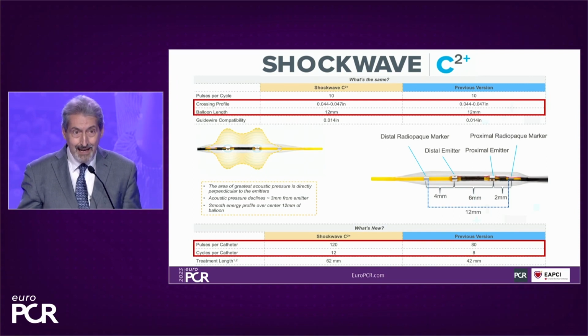So you may say how to treat. Normally I would have predilated, inserted an OCT or an IVUS catheter, and acted upon them, but I know that I need some sort of technology to modify this calcium. And of course, if I don't cross, I would go for the rotational atherectomy.